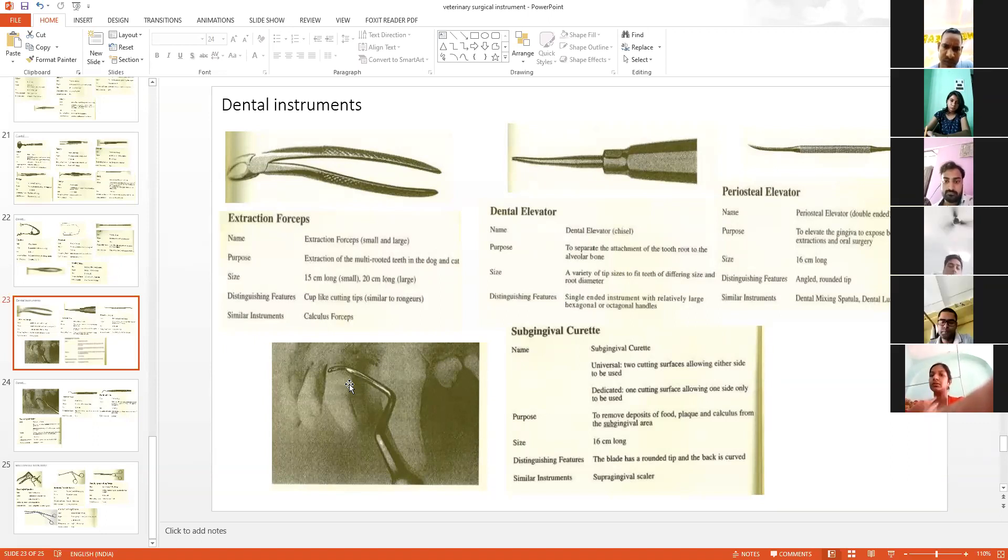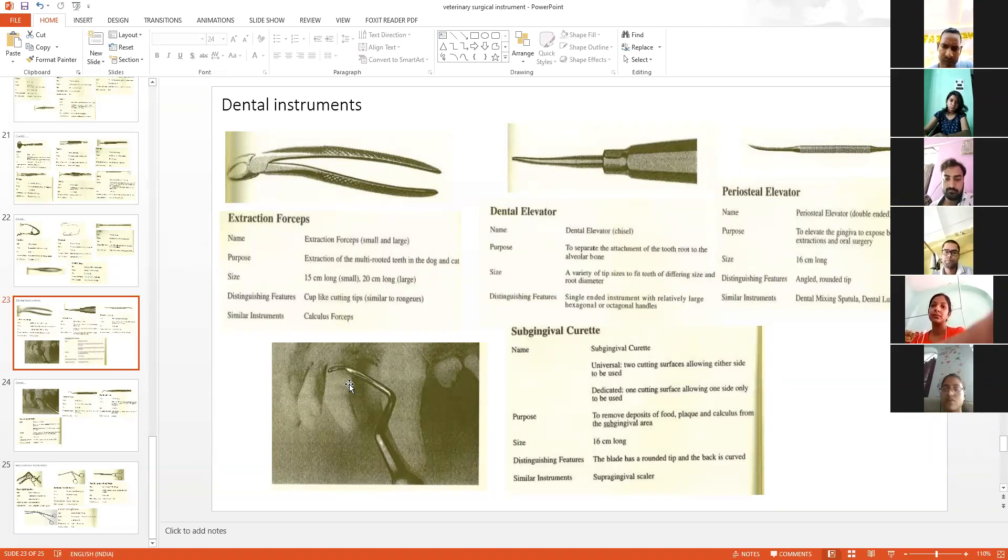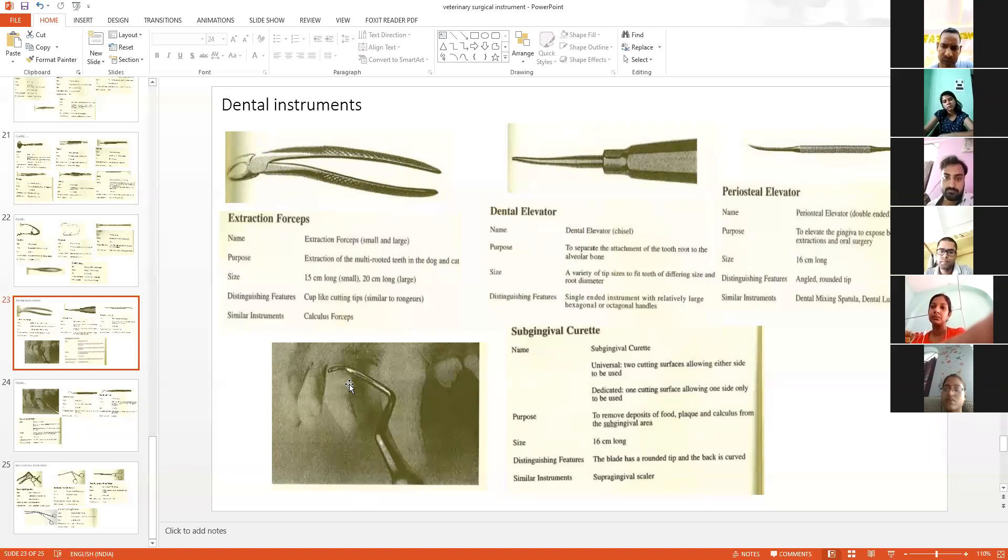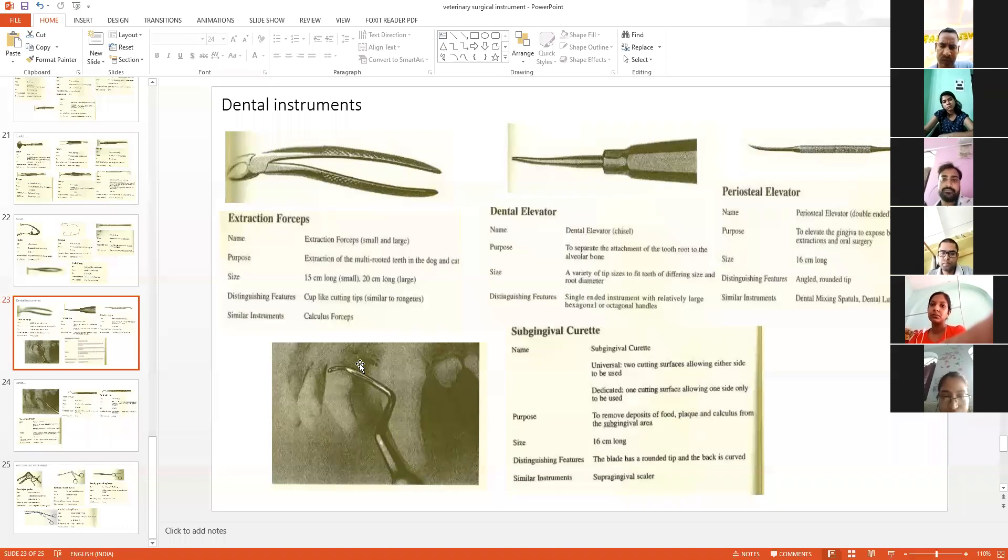This is most commonly used for scaling. When there is a halitosis problem, bad breath, it's due to the deposition of tartar and food debris. For the removal of food debris and tartar deposition, we use this instrument.